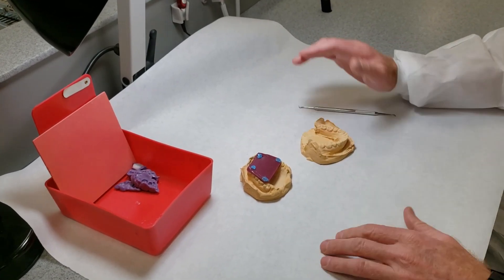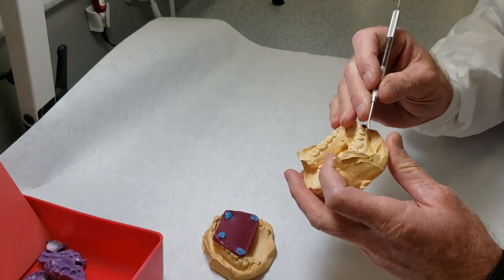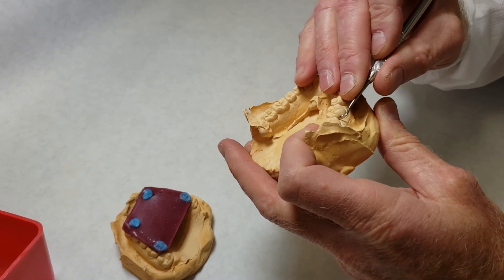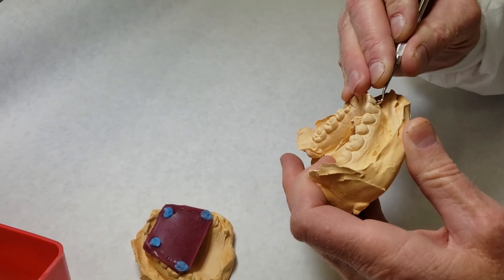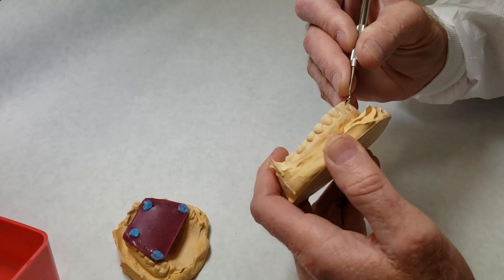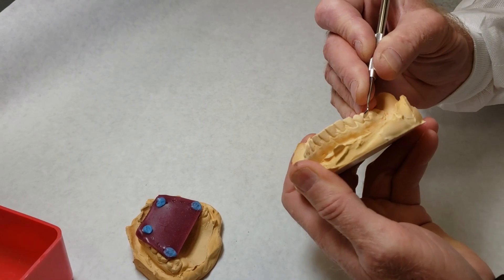It's always easier to groom your casts when they are dry — you'll be able to see the little blebs and imperfections a lot better. We'll start on this cast; I'm using a Tanner Carver and I'm just going to go around and dress it up a little bit. These bubbles or blebs that occur on the facial and lingual surfaces are not as critical as the ones that affect the quality of our mounting, but they do help the cast to look a little bit better.